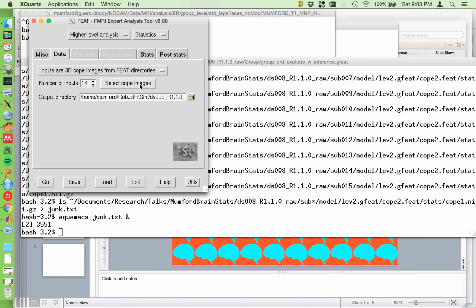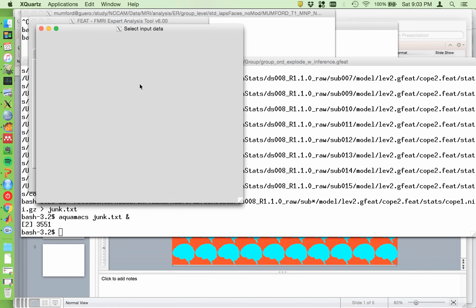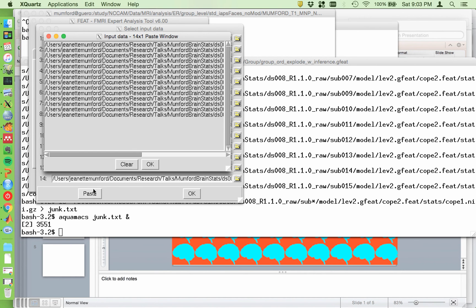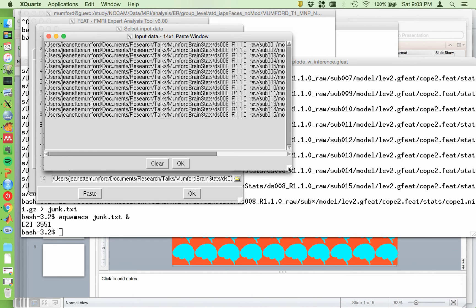So I'll show you a trick for putting the copes in. It's not super magical, but, and it may have done this for the level 2 analysis. So you can see I need to put all these paths in here. And there's a paste button here. So I try to take advantage of paste when I can. And I'll show you what I did to get all these paths.